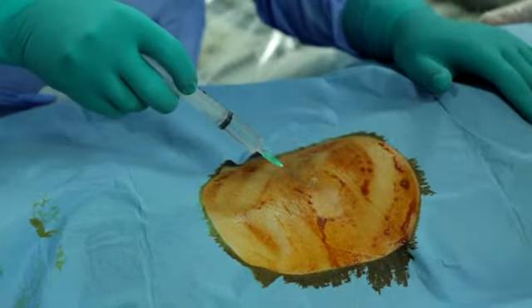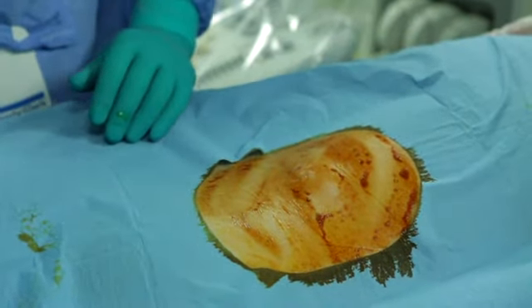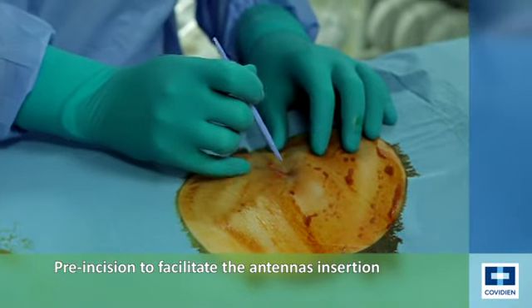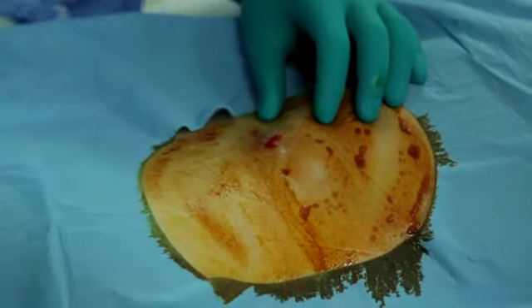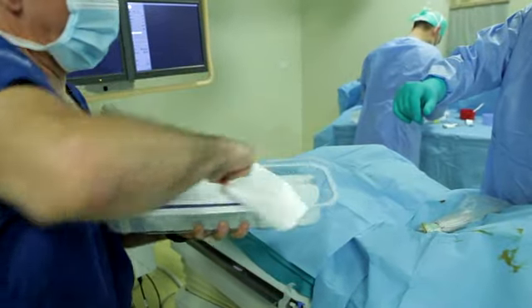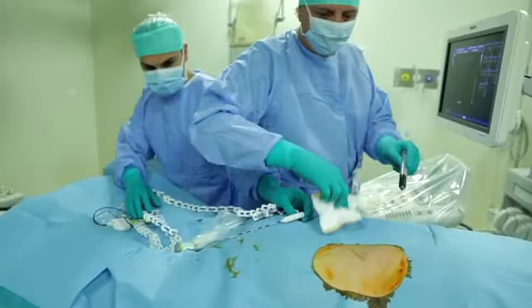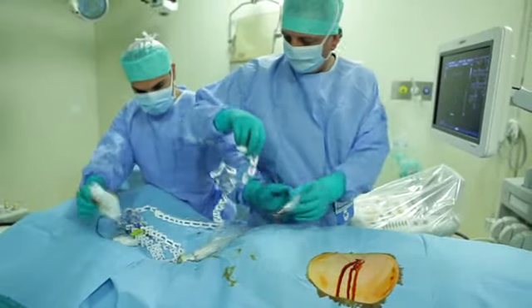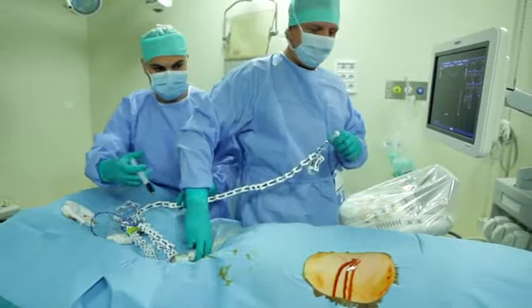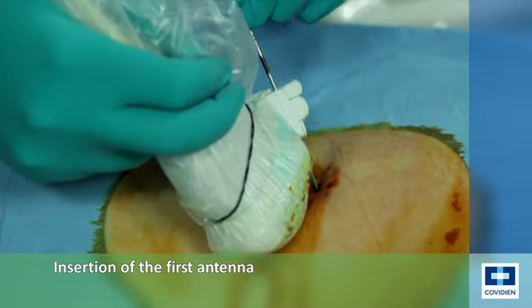We started to use microwave ablation in 2008, and now we have very good results. Usually the decision making is performed by a group of different medical doctors. This is a multidisciplinary team where oncologists, anesthesiologists, pneumologists, thoracic surgeons, general surgeons, and interventional radiologists work.